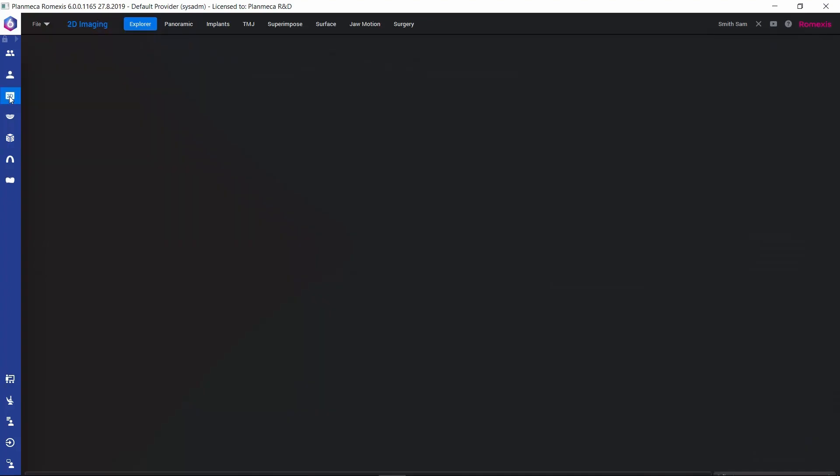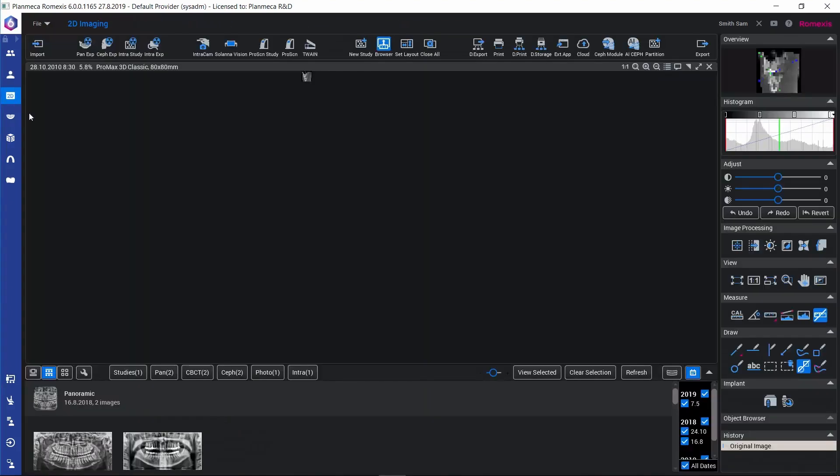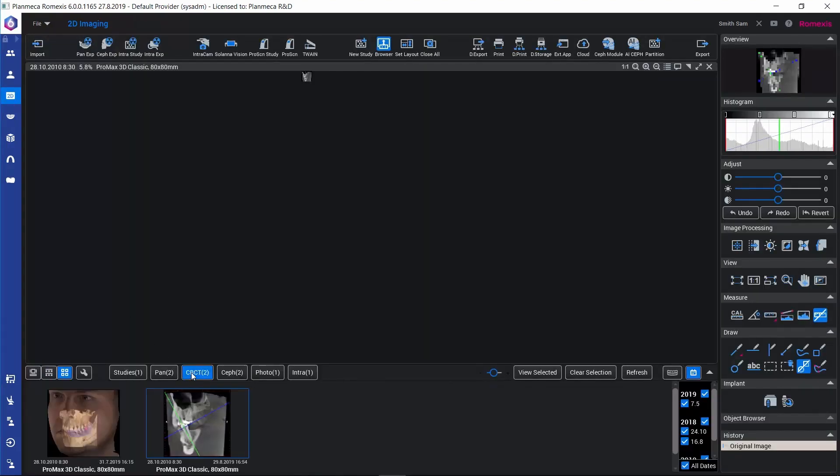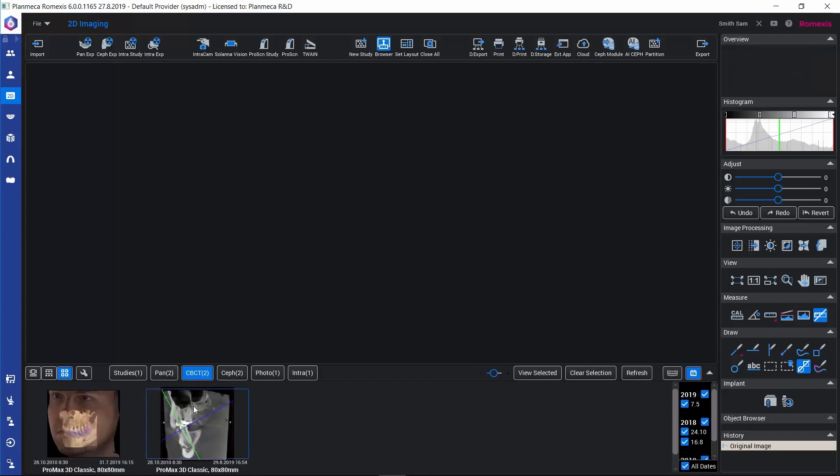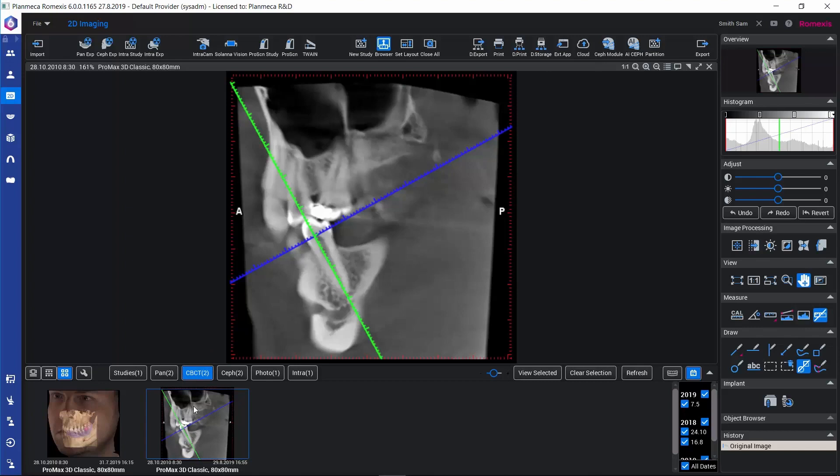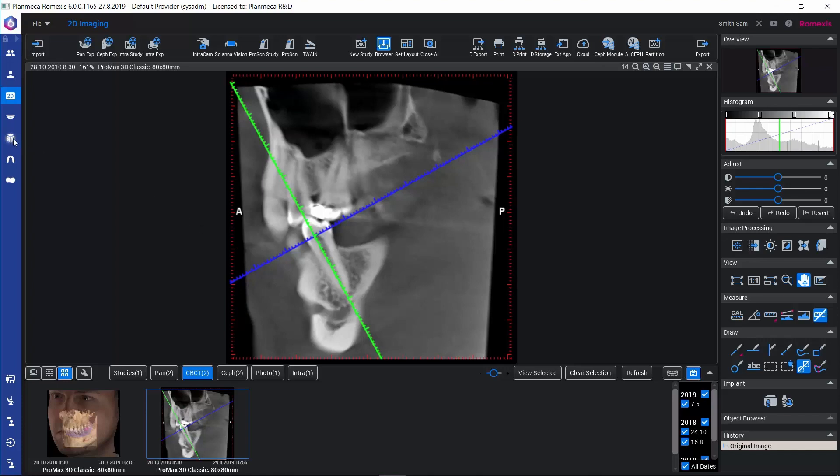Let's go to the 2D module and we can see our 2D snapshot here in the CBCT category. This 2D snapshot we can further process with the 2D image processing tools and we can also make annotations on it. Let's then go back to the 3D module.